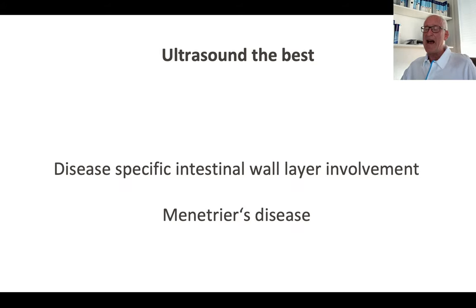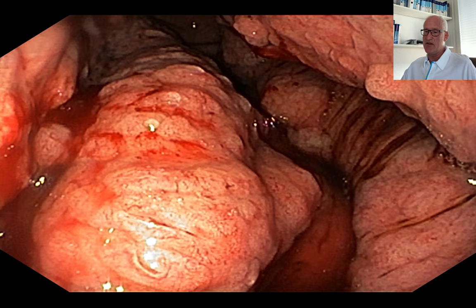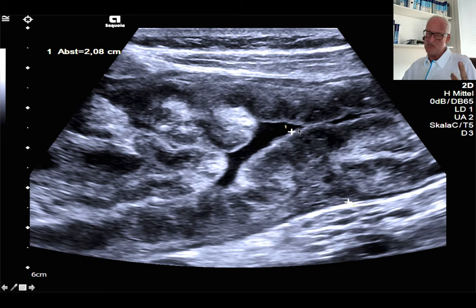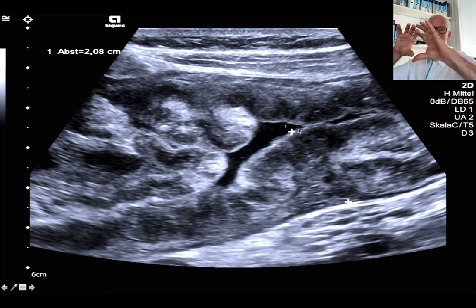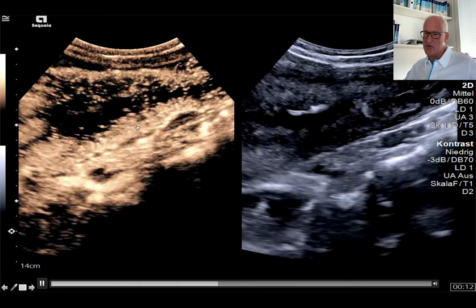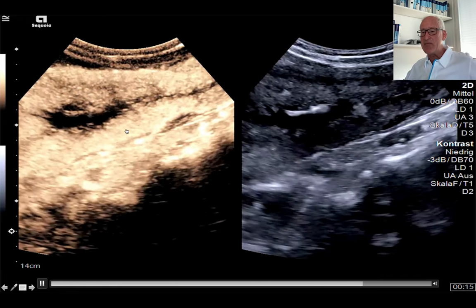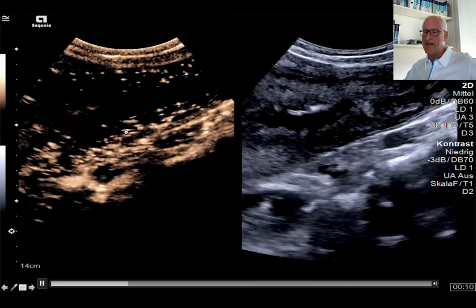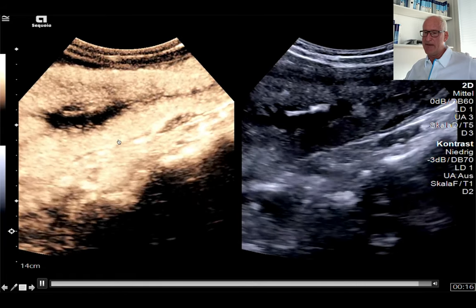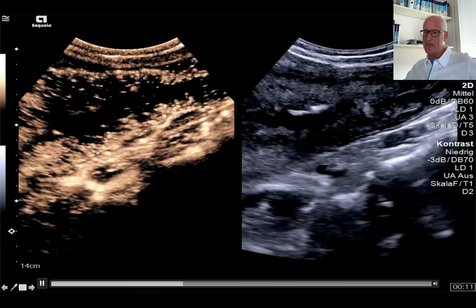Let's go to an eye-catching feature: Menetrier's disease. You can see the large folds of the gastric mucosa. The muscle proper layer is intact, and all that thickening belongs to mucosa and submucosa. You can be sure it's not an infiltrative process spreading beyond the gastric wall. Contrast-enhanced ultrasound shows enhancement from the outer to the inner parts, and you can nicely see vessels penetrating the muscle proper layer in real-time imaging.